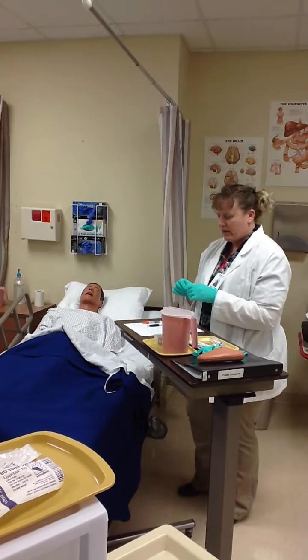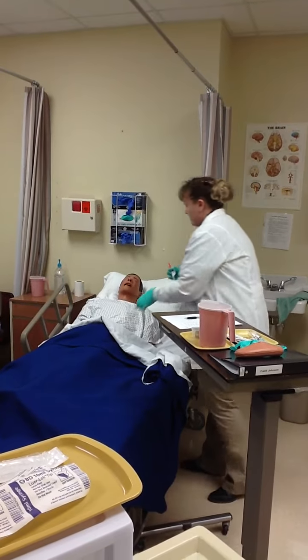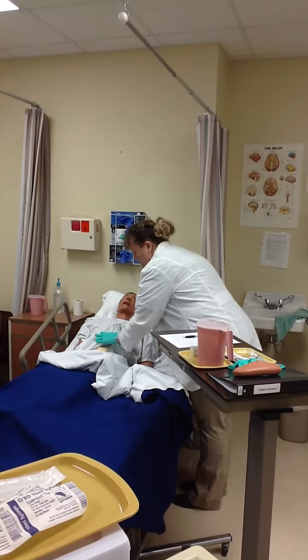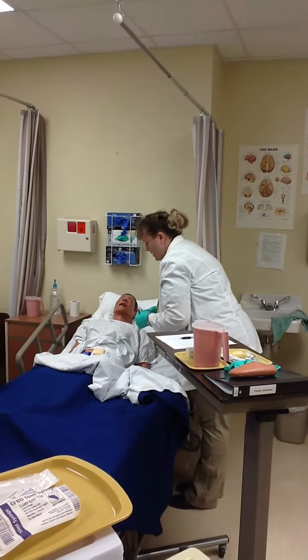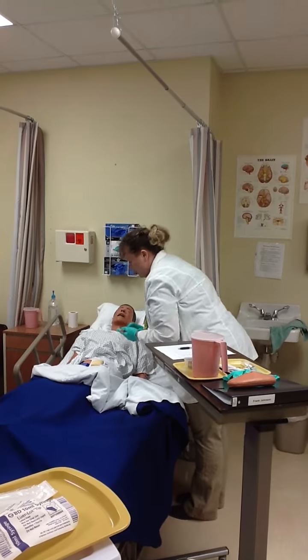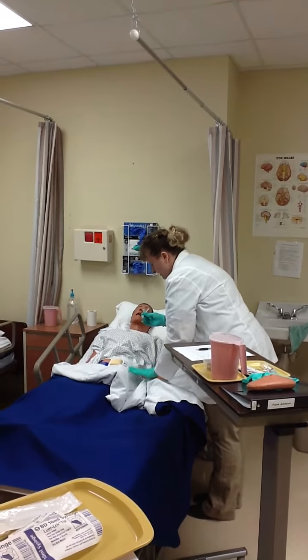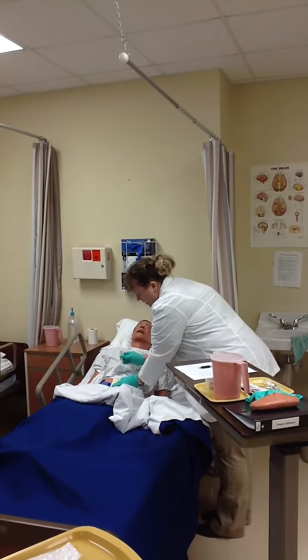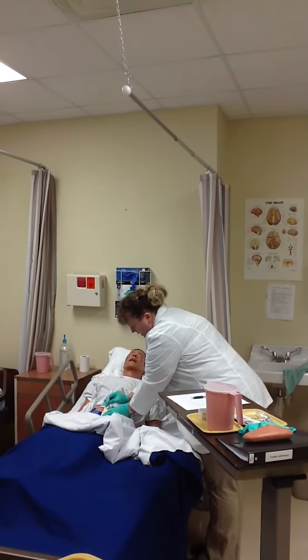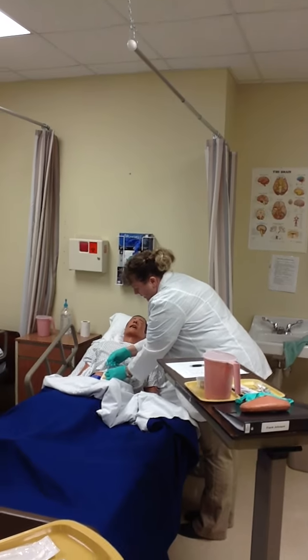Put on my gloves. I have my alcohol prep. I have my insulin. Mr. Johnson, I'm going to expose your abdomen. I'm going to pick my site. I'm going to clean that. And once I've done so, I'm going to remove the cap from my syringe and set it down. I'm going to grab a pinch of that fatty tissue because it is subcutaneous. I'm going to go in at a 90-degree angle, big stick. And I'm just going to stabilize that needle and push in that insulin.